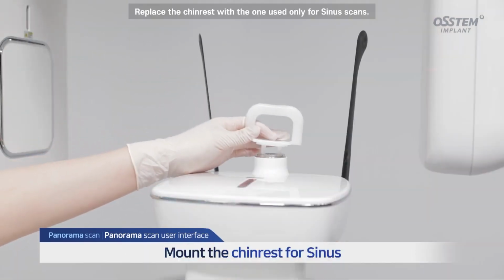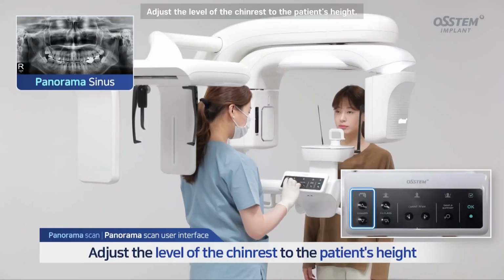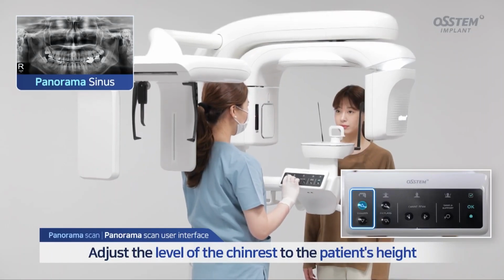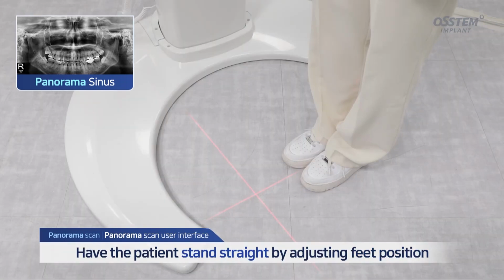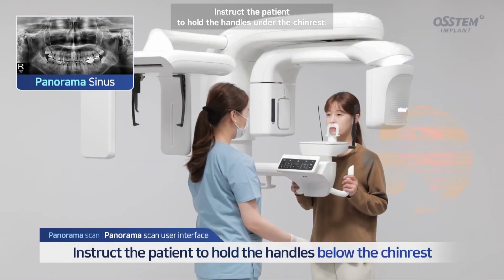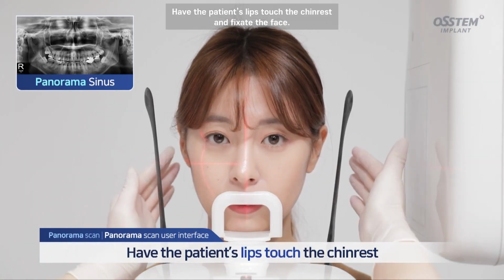Replace the chin rest with the one used only for sinus scans. Now, let's talk about the sinus scanning position. Adjust the level of the chin rest to the patient's height. Have the patient stand straight with their feet in a comfortable position. Instruct the patient to hold the handles under the chin rest. Have the patient's lips touch the chin rest and fixate the face.